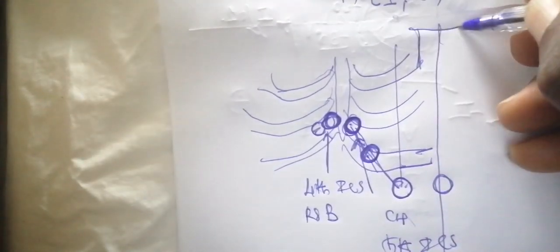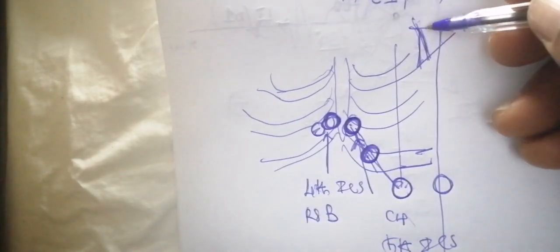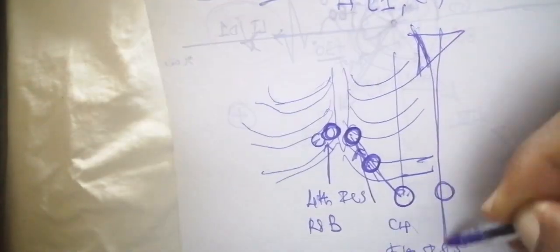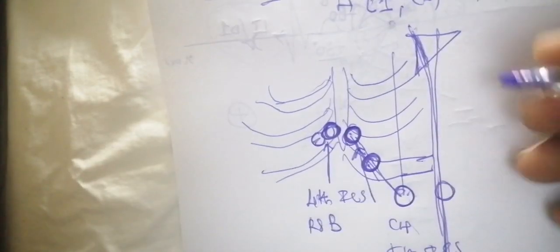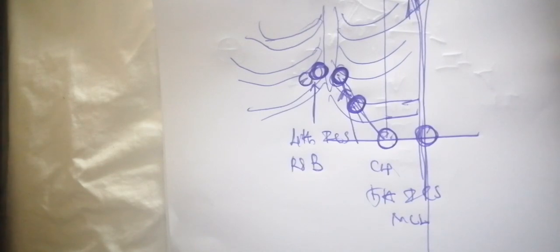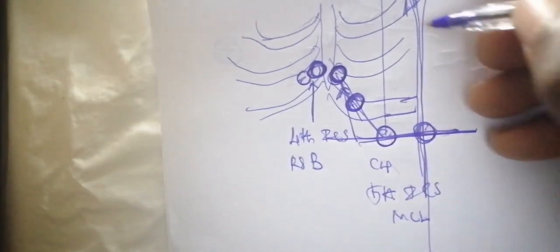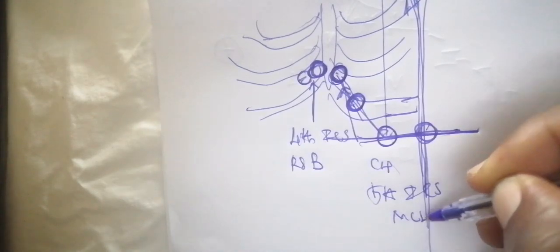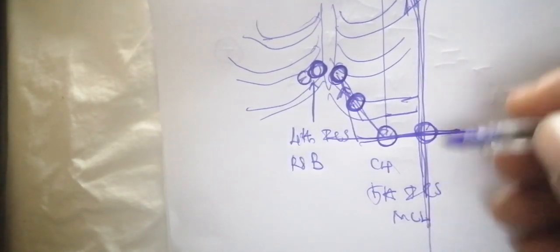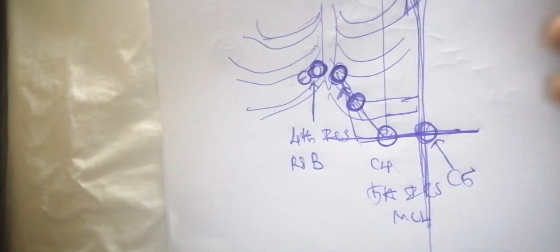So when somebody raises up the hands, we have the axillary line that can be drawn downward from the anterior aspect of the axilla. Is it clear? That is the anterior axillary line. So the 5th intercostal space or the inferior mammary line, the line directly underneath the breast, and the anterior axillary line is going to be the location for C5.